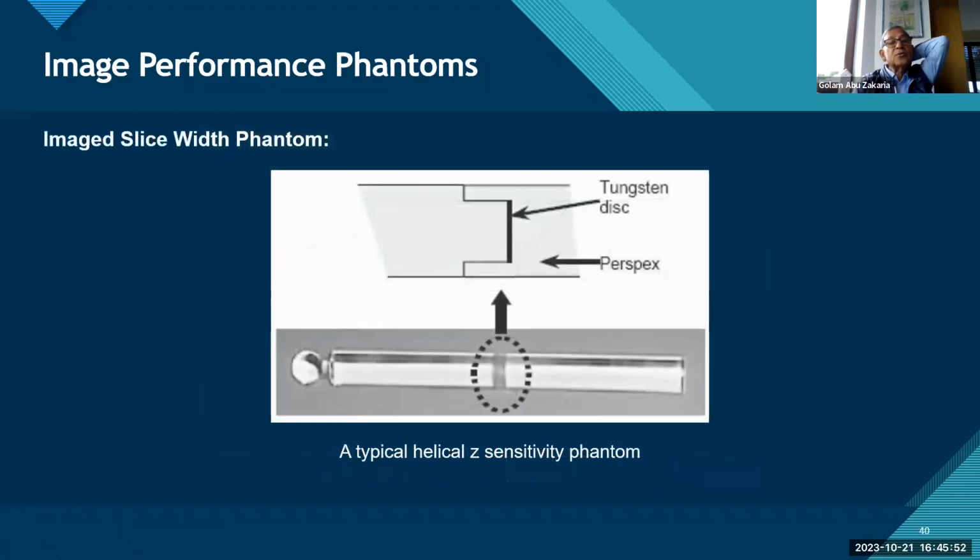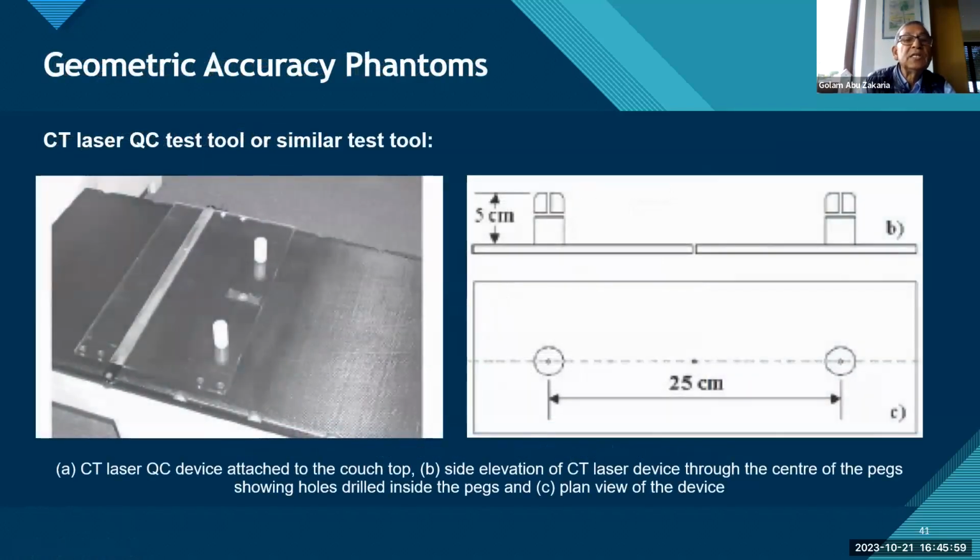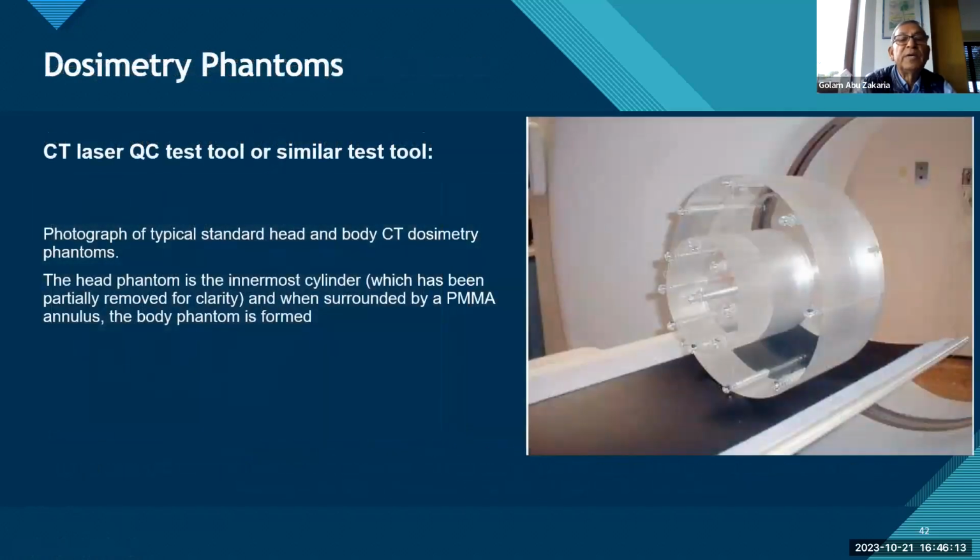And of course, here also the sensitivity phantom. And then here you see the laser devices phantom is also possible. But as I told you, there is a program. With this program, you can control all the parameters. This is important for medical physics.